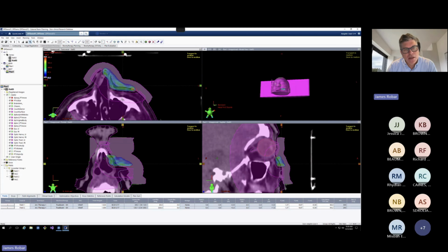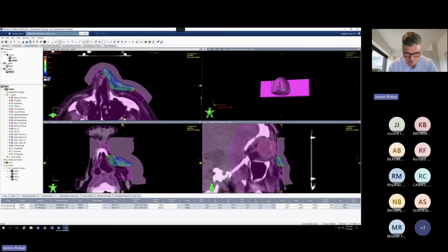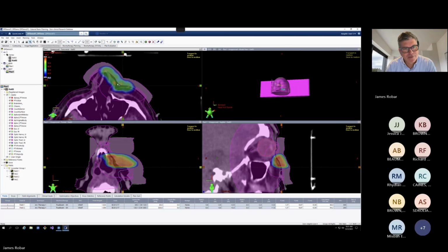So generally, as you might have seen in the past, if you've ever compared IMRT and VMAT, kind of a smoother, less streaky dose distribution. The hotspot was a little higher here, 105.3 than our IMRT plan, although still acceptable, I would say. And then, according to that Dana-Farber study, if this is representative, we should see a little more compactness at the 50% level.